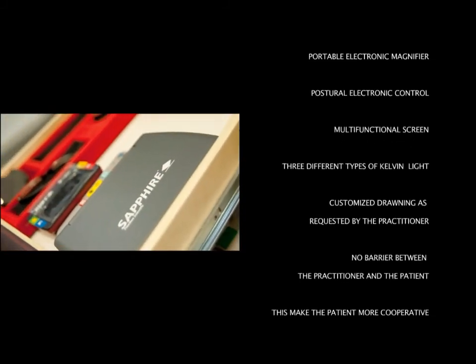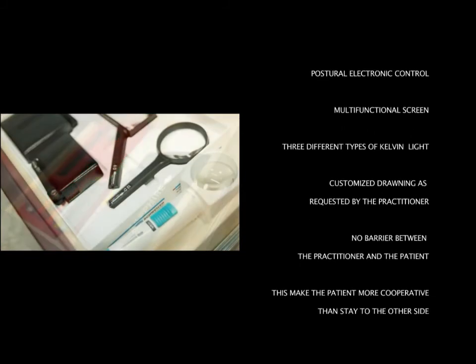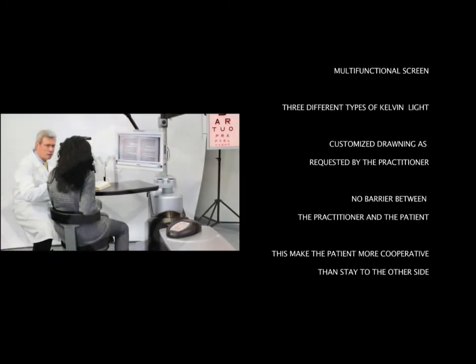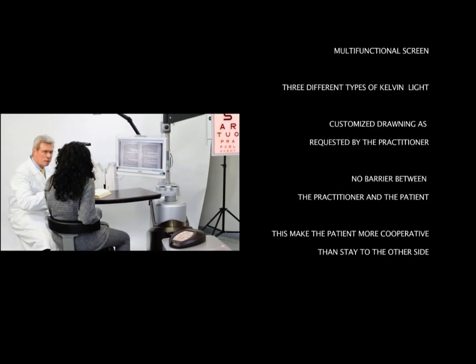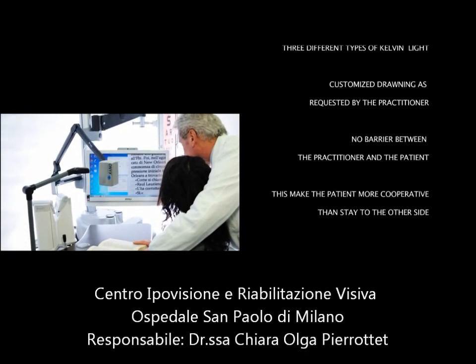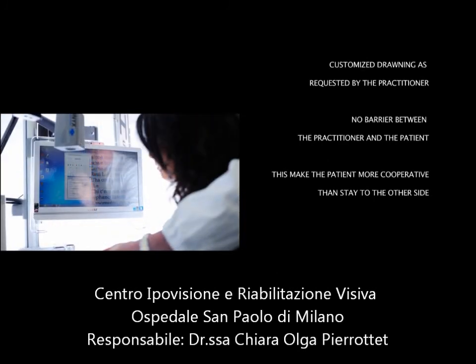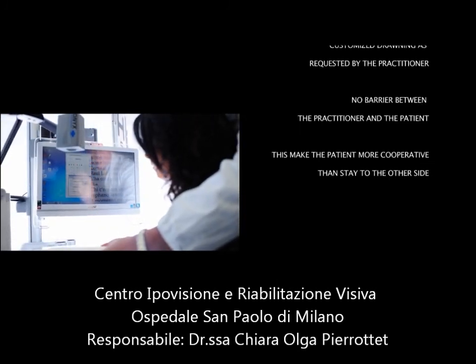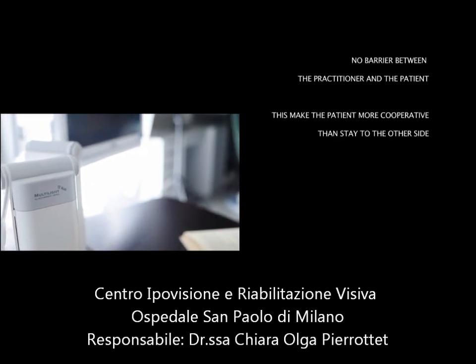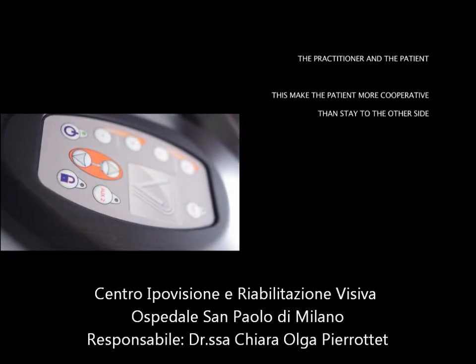full cooperation. In a rehabilitation center equipped with a low vision workstation, the first positive observation of the patient is that it is very comfortable being alongside the practitioner rather than separated by a table of instruments. In addition, it's beneficial to have all the tools at your fingertips.